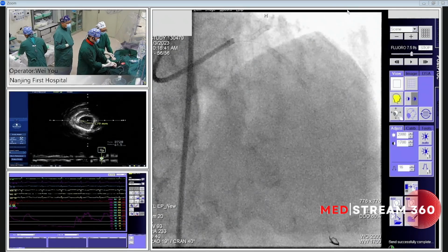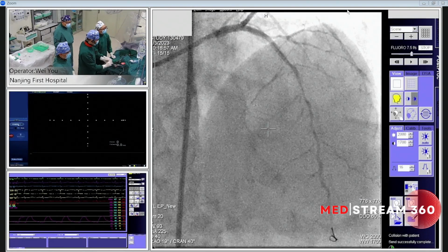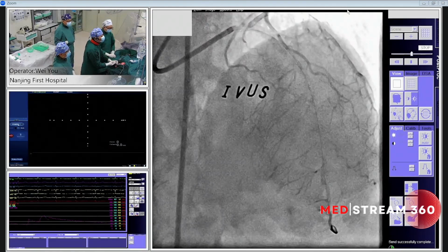Nitro again, please. Okay, we'll take a picture for you. Okay, better than before. It's a large spasm.